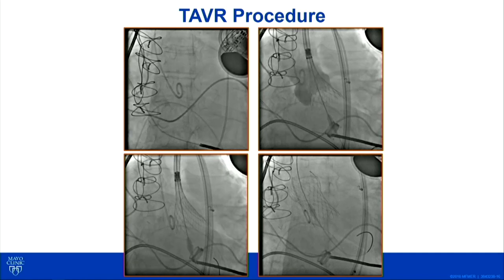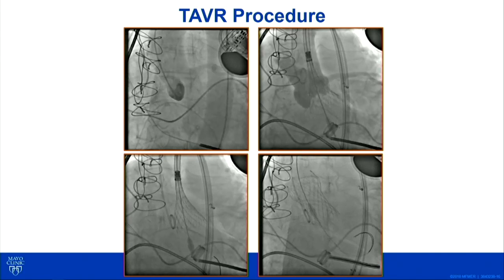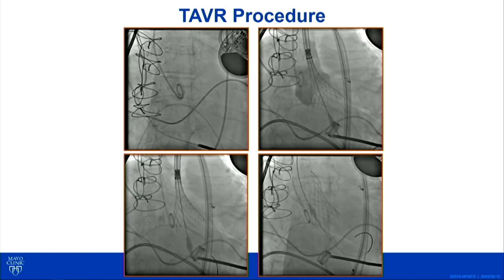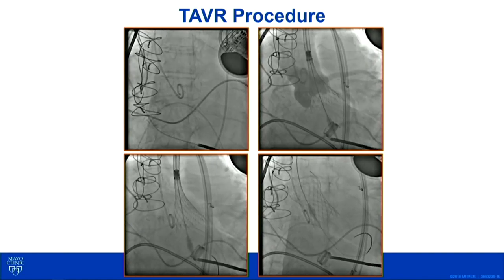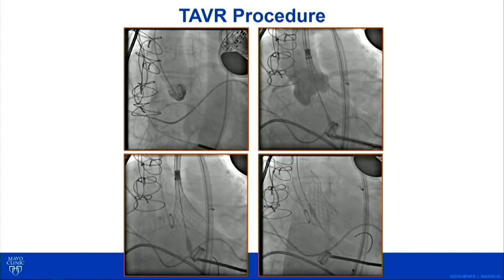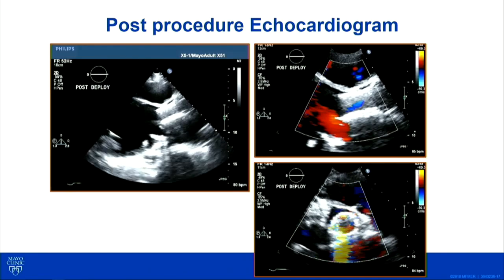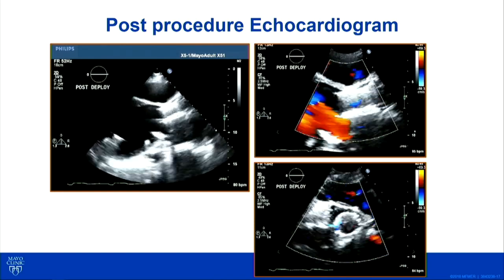Initially, the depth was too much. At this point, we decreased the RPMs on the LVAD to help reduce some of the suction force on the TAVR valve. Then we did some pacing at 110 to 120 beats per minute, which is typical for these types of procedures in LVAD patients. After several repositioning attempts, we were finally able to get a good position about 4 to 5 millimeters below the annulus. It probably was a little bit deeper than that when you look here at the transthoracic echo, but we didn't have any significant aortic regurgitation.